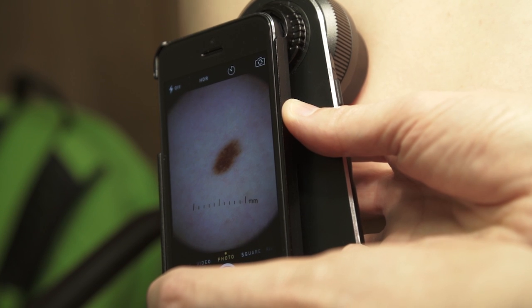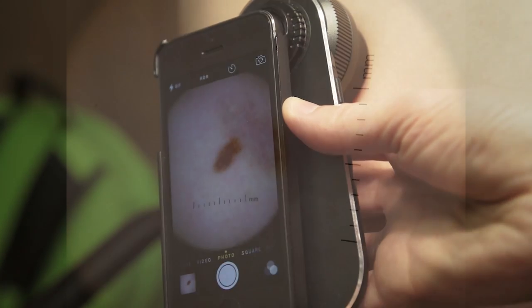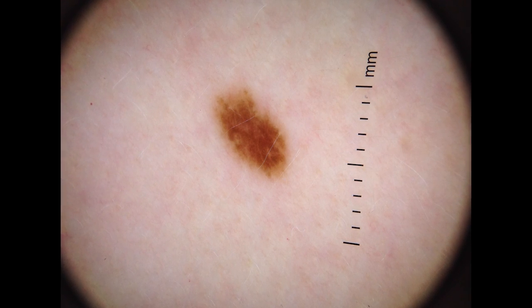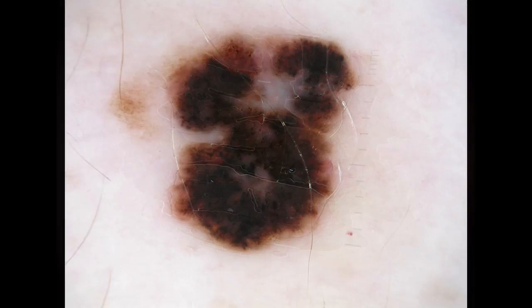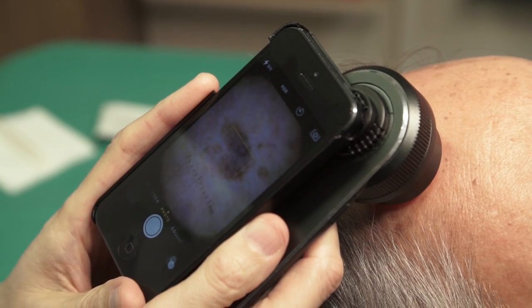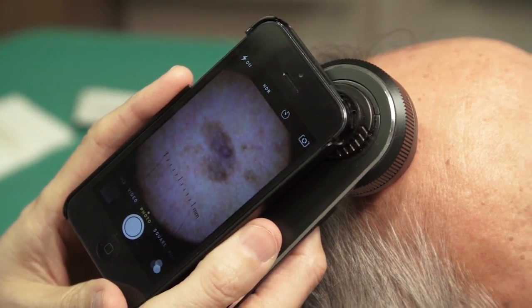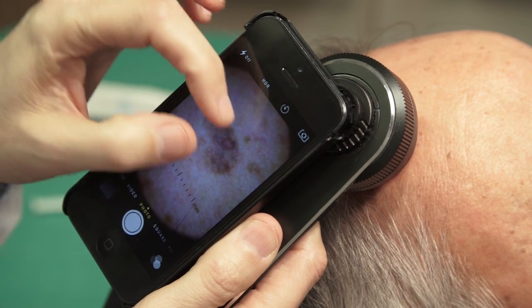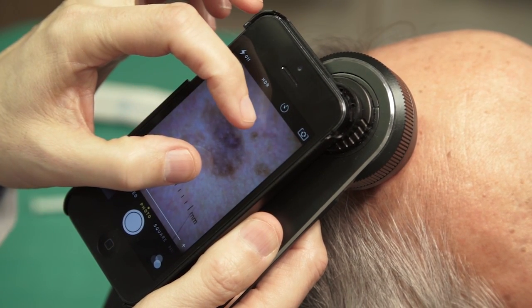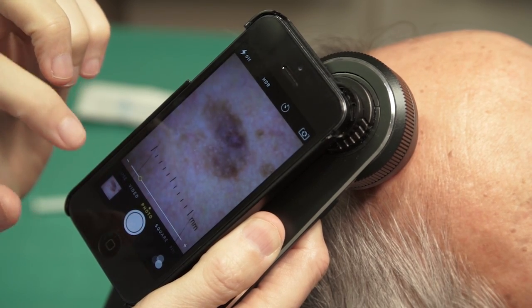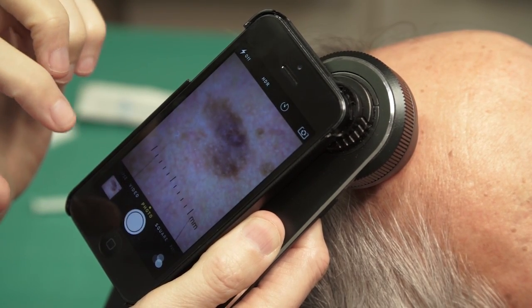Dermatoscopes are especially useful for distinguishing between a benign nevus, such as this one, and a malignant melanoma. Men with thinning hair are very prone to skin cancers of the scalp. Here we are making sure that a pigmented area of the scalp is only a benign solar lentigo and not an early melanoma.